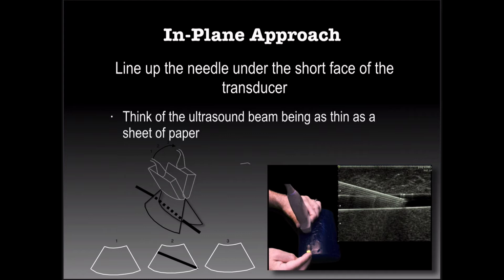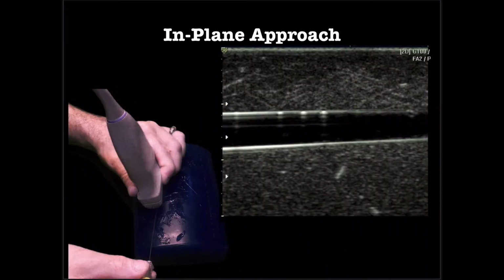You don't have to worry about that when you're doing thoracentesis and paracentesis, those kind of procedures. So this is a good technique for other procedures, but I have to show you this procedure even with vascular access, okay? Because I'm going to show you how to use this to finish off your procedure in a minute.